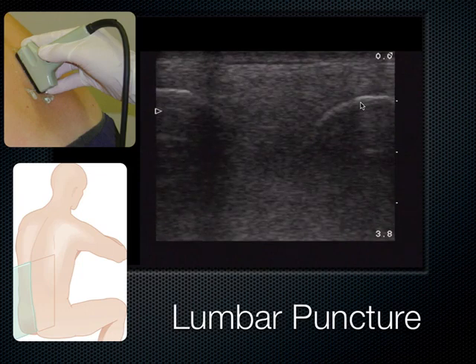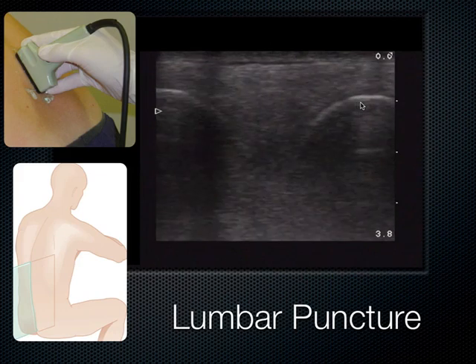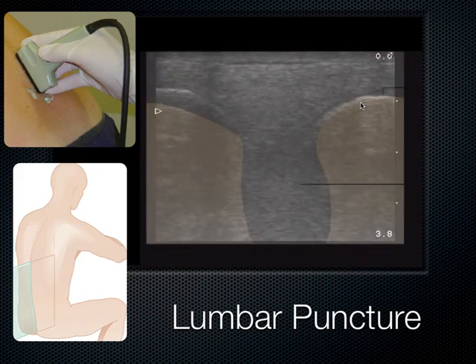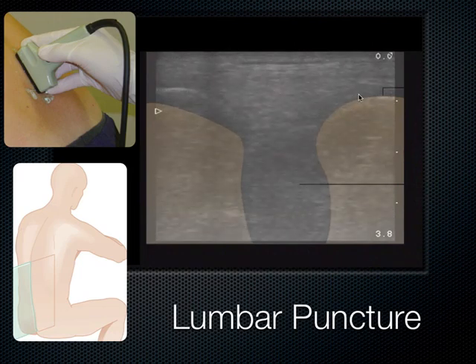And my fellow from last year, Connie Chan, who many of you obviously know and remember, created a nice video on how to do this. And these are the vertebral spinous processes seen here.